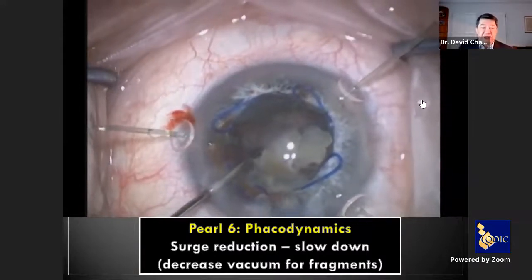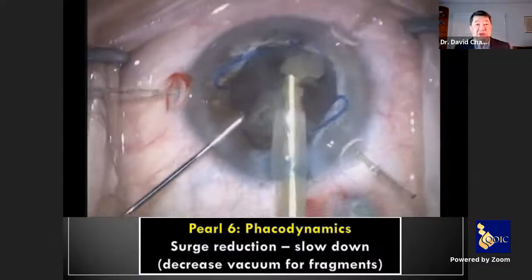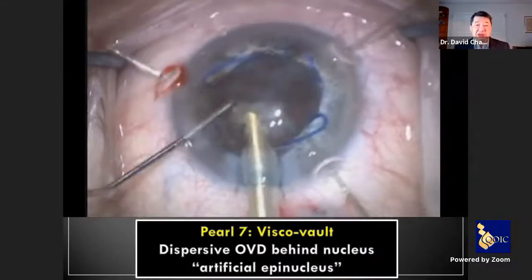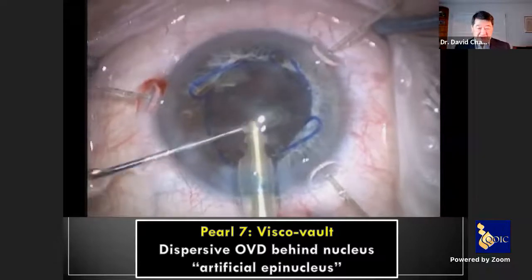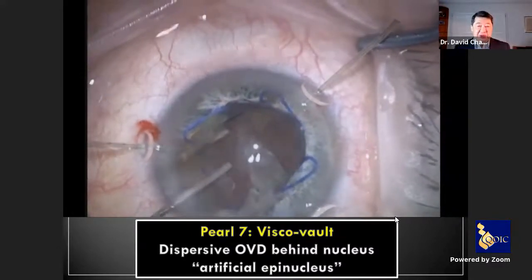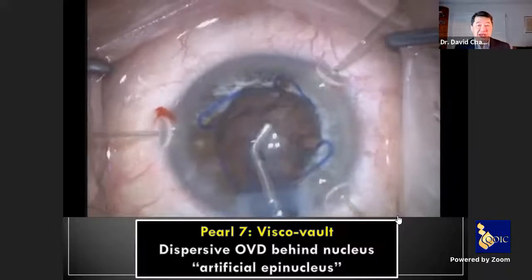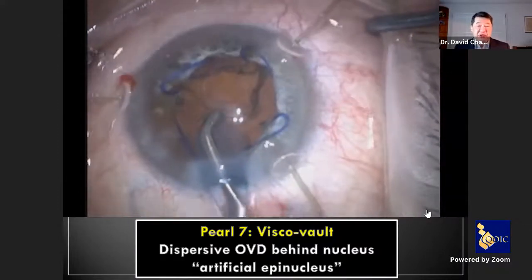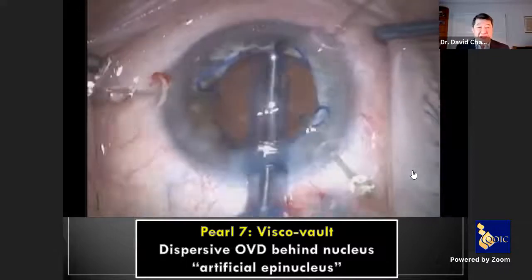Now, notice here, I'm going underneath the nucleus. That's important because as more of the posterior capsule is exposed, remember the zonules are weak, and that posterior capsule is not as taut as it normally is. So this viscoelastic vault is not only pushing the capsule away, but it's stretching the capsular bag. And I'm putting the chopper underneath. It's stretching the capsular bag so it won't come up to the phaco tip. Notice how with just this last little piece, this is still when you can aspirate the posterior capsule. So I paused. And I totally, again, put dispersive in, which resists aspiration, to stretch the capsular bag and to then put it on stretch to essentially take the place of the zonules normally putting the capsular bag on stretch.